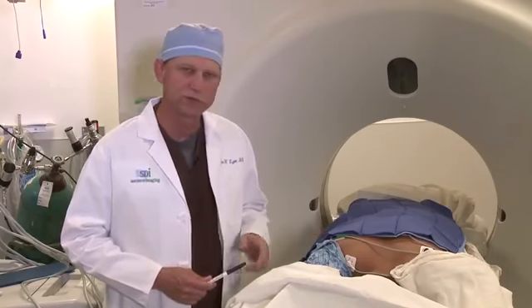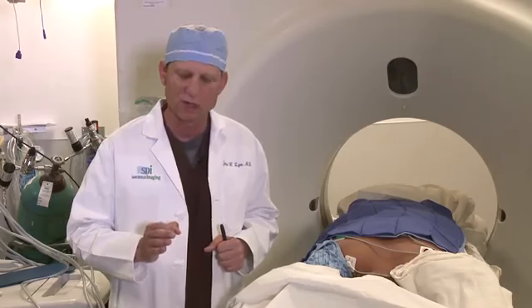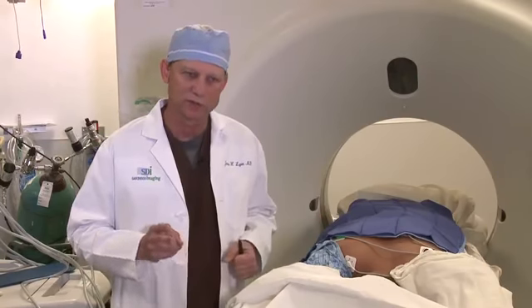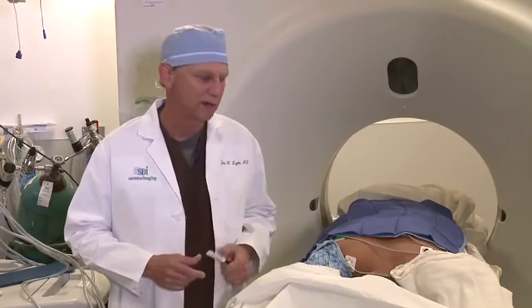This is a 68-year-old gentleman who presented with gross hematuria. CT scan showed a largely exophytic mass from the interpolar right kidney. Its maximum dimensions are about 25 by 25 by 35 millimeters. Its long axis is not particularly favorable today, so we're going to have to use 3 or 4 probes going forward. That remains to be seen.